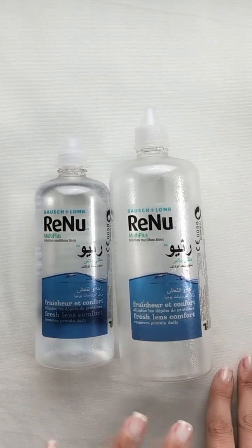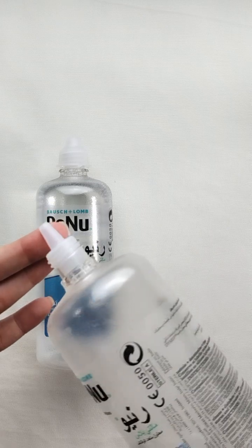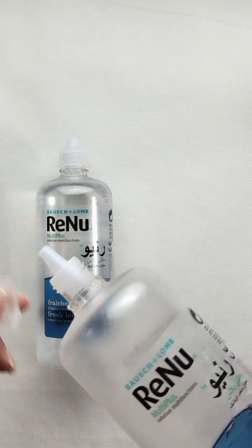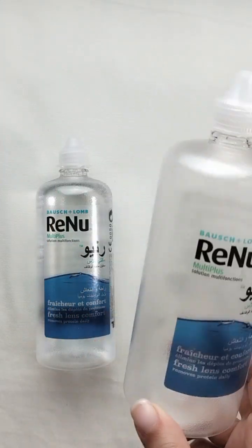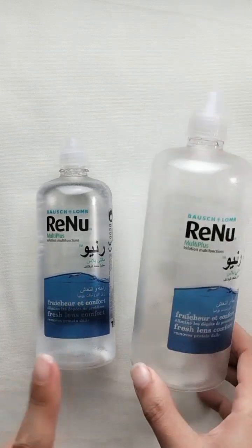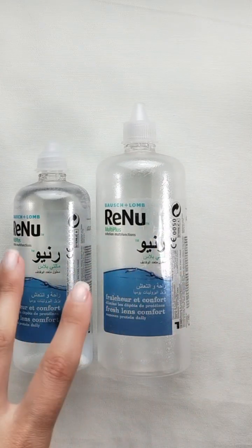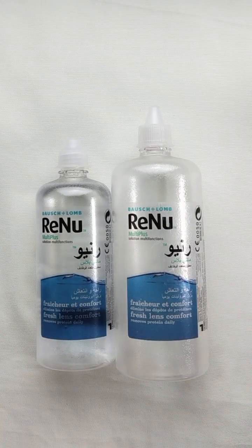After the bottle is empty I reuse it — it has a nice nozzle, so I can add a little bit of oil and apply it to my scalp, or swap the nozzle for a sprayer. You can remove and reuse it, which I always do. If I don't need it I throw it away, but it's a nice extra use. I also love the packaging — it's really clear and beautiful.